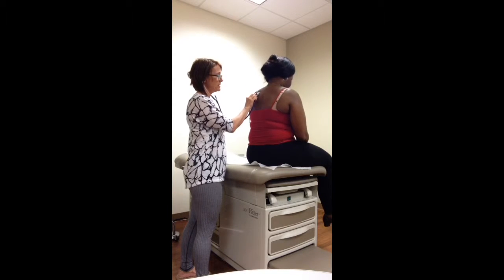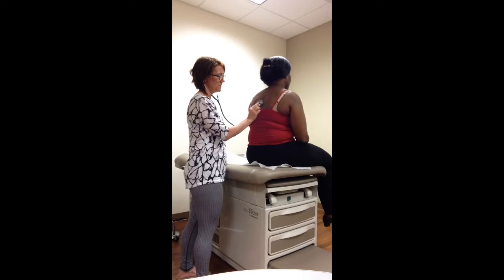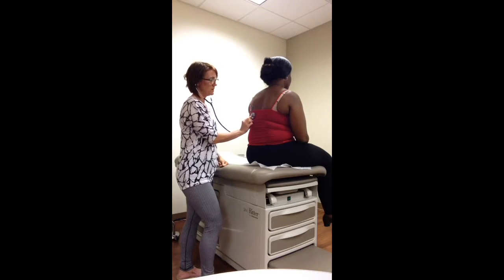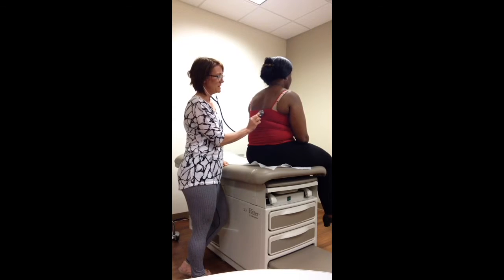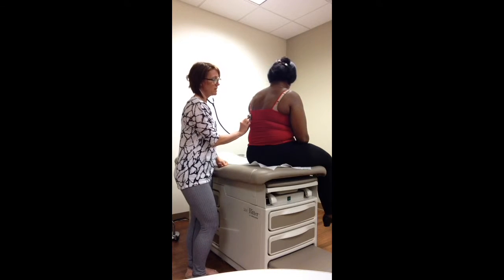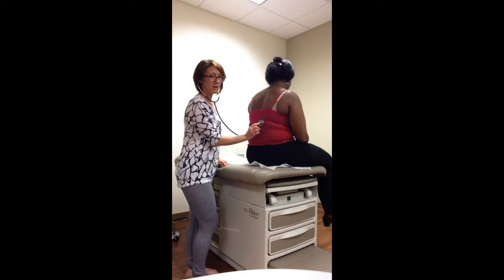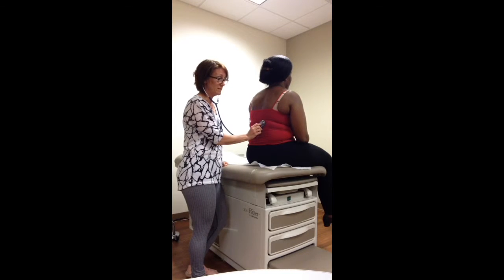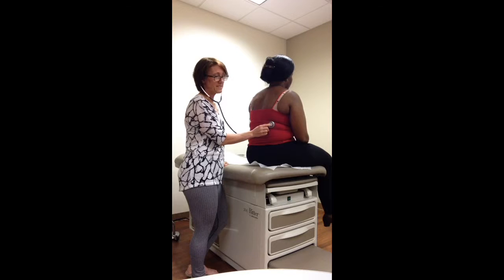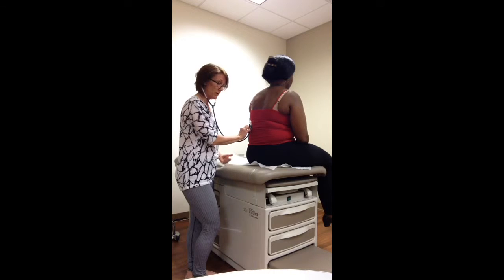So if you can take some deep breaths. So you're going to be listening for inspiration and expiration. And you're going to be listening for any abnormal lung sounds. Now, when you're listening on an older person, you want to take into account that it's hard to continually take deep breaths, and it could possibly make them hyperventilate or become short of breath. So sometimes you'll have to give them a break.